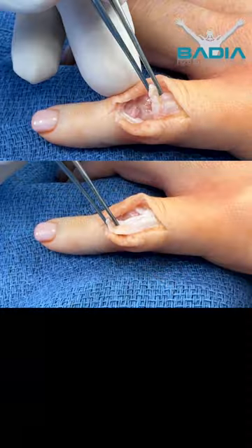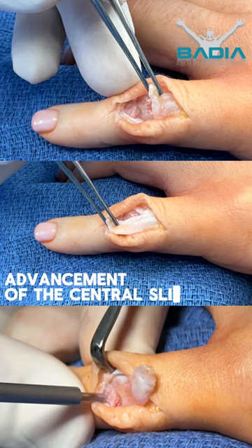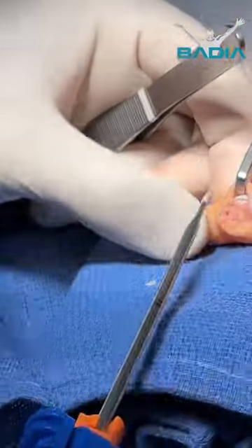The procedure involved a capsulectomy to extend the finger, advancement of the central slip, and pinning the finger in extension. The patient will return for pin removal in four weeks.